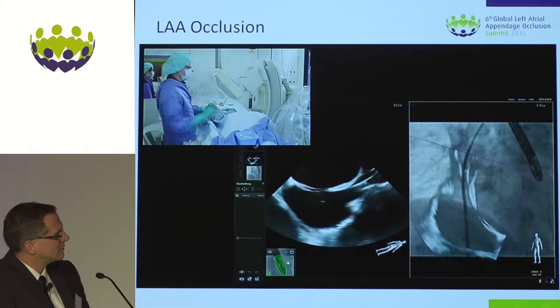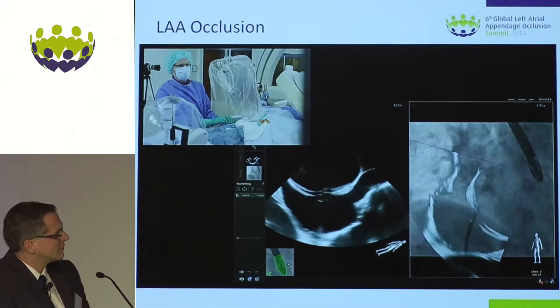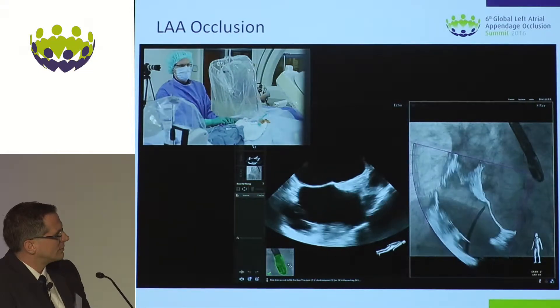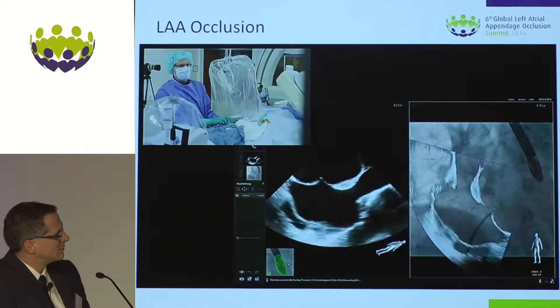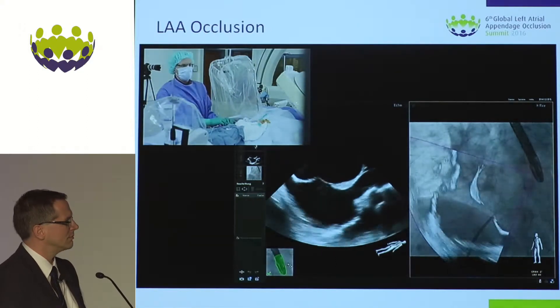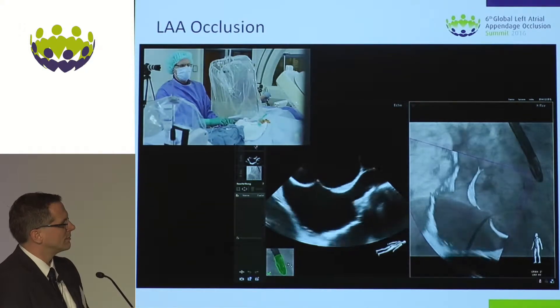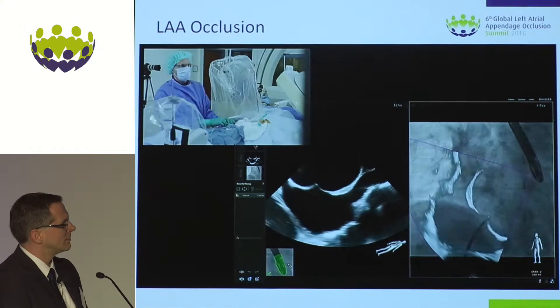I'm coming down. I've got a nice overlay on the right part. I'm now in the apical, cranial part of the fossa. You can see the tenting. I want to puncture in the inferior part. Now I'm in the inferior part of the fossa and we are going to check in the 45-degree short axis view whether I'm anterior or posterior.